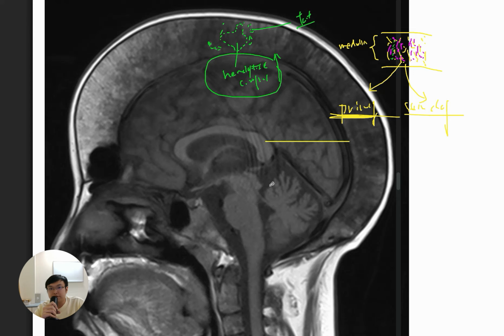For example, you have two cortices here, and the primary trabeculae support the bone like this, and we also add additional ones called secondary trabeculae, which are less important, so they are thinner and less supportive, but they usually will be present in normal bone. Whenever we have expansion of the marrow and we break all of these, the stress on the primary trabeculae will increase, and they will further thicken.